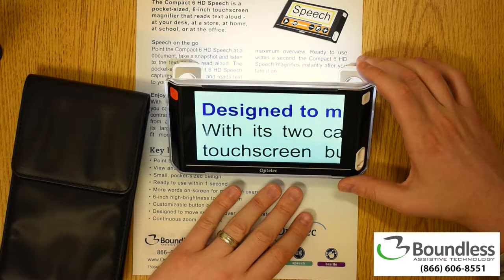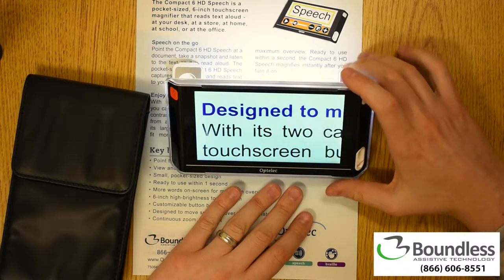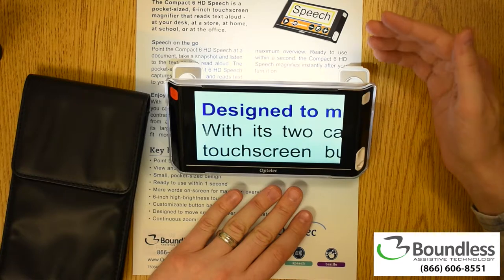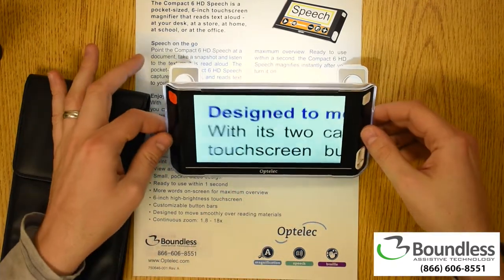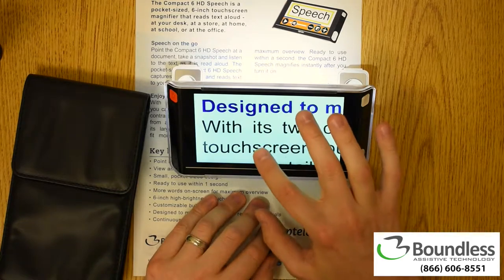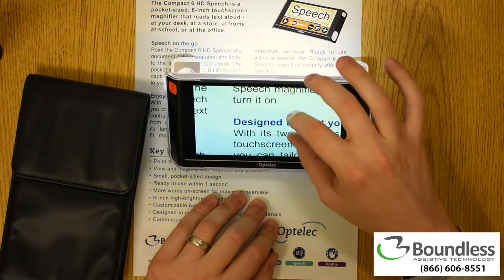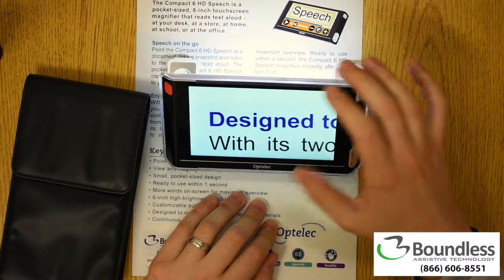Boundless AT is proud to show you the Compact 6 HD with Speech from Optelec. This is a six-inch HD magnifier that boasts a touchscreen and two HD cameras. This is definitely bigger than your traditional handheld magnifier, but not so big that it's a burden to take with you. It actually has quite an incredible picture quality, and most people we show this to are very impressed with how clear the letters appear.